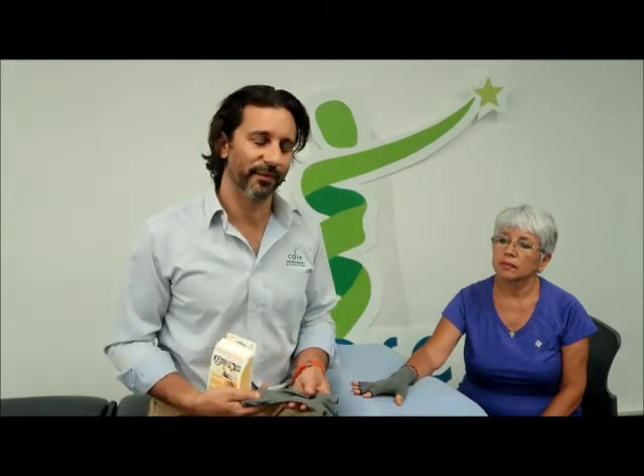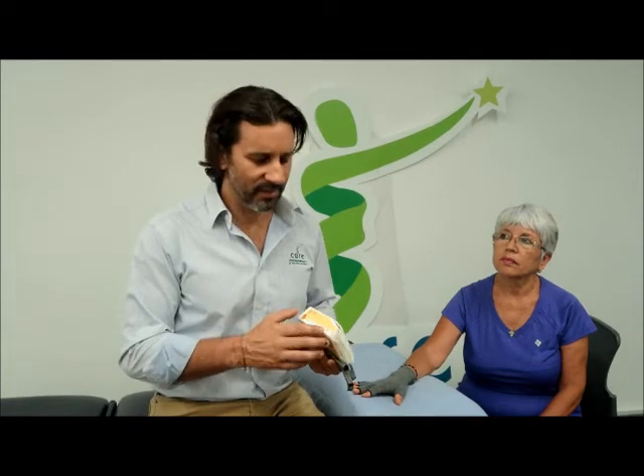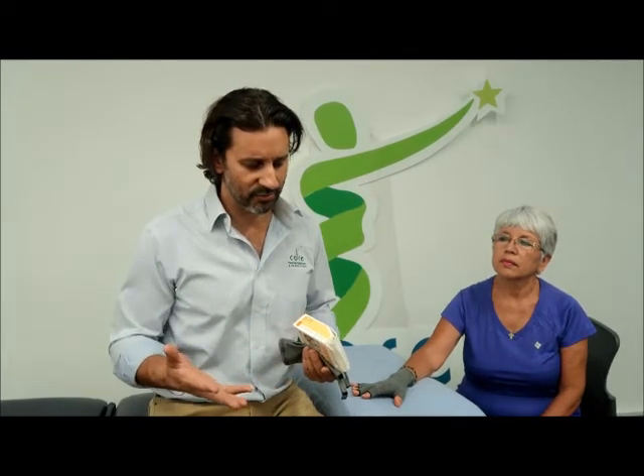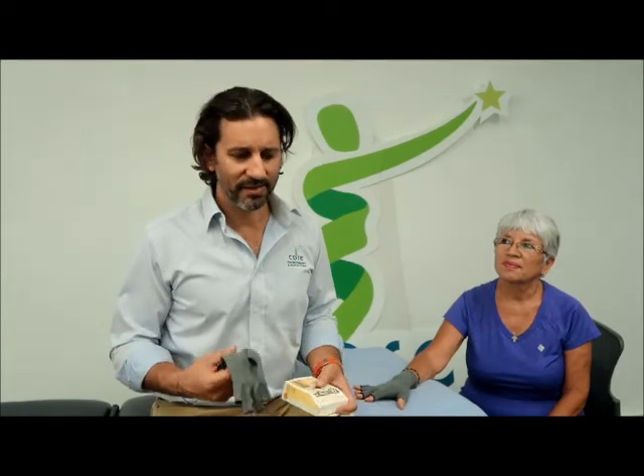So that's the arthritis glove. It's a great item and people really love it — they get a lot of benefit from it. There is a sizing chart on the side of the box, so you can measure your size. They come in extra small, small, medium, and large, but I would really recommend making an appointment with your local physio to have a look at your hand and wrist and make sure it's the right item for you. Getting that right compression can mean the glove feels great or doesn't work as well.